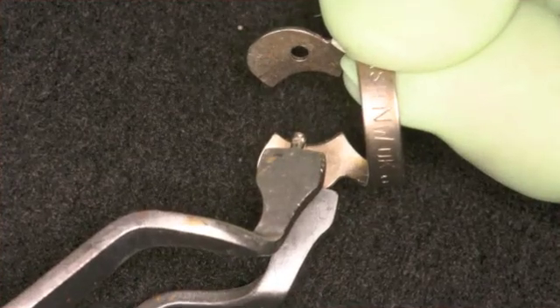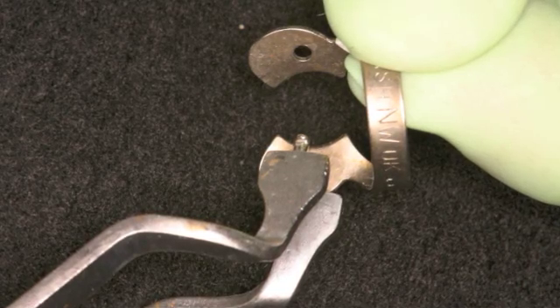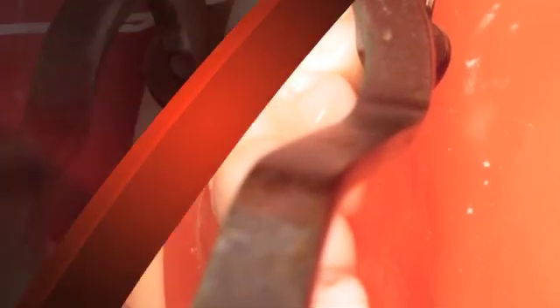Next, engage the rubber dam forceps in the holes on either side of the clamp and gently squeeze to expand the jaws of the clamp. Seat the clamp on the tooth from a lingual to a buccal direction.